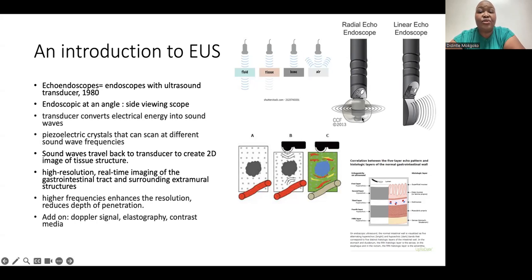The transducer sends through sound waves. Electric waves that are put through the machines are transformed into sound waves through the actual transducer, and that's sent out into the tissue. And depending on the quality of the tissue, it interacts with those sound waves in different ways.